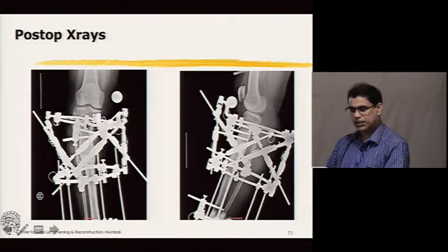So the osteotomy was done a little lower. Therefore, that question of always needing to do the fine tuning made sense, because if we had gone ahead and planned a simple hinge and done the osteotomy at the earlier level, and not taken into account the translation, then we would have done an under correction.